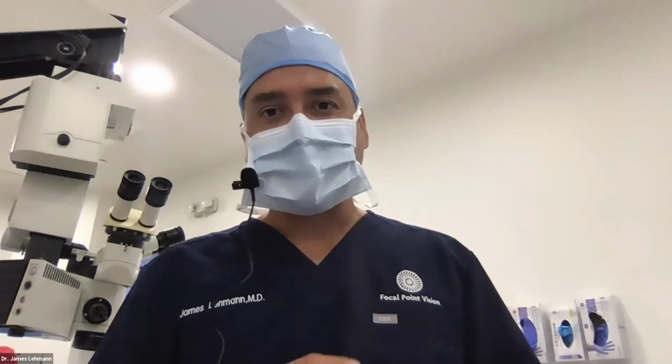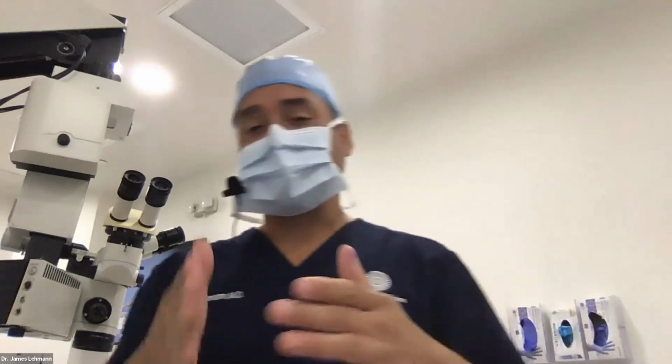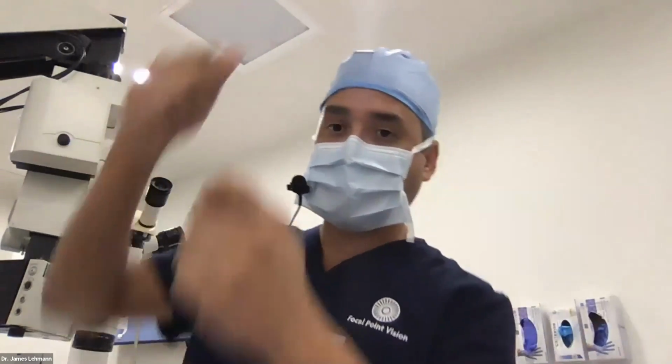Dr. Longdong Huang asks, why divide the nucleus not completely? Can lead to posterior capsular tear. Yeah, that's true. So especially in the beginning, you want to make all 4 quadrants before you remove them. Because you're right, if you get a heminucleus and you pull it up, it can rotate and hit the back part.